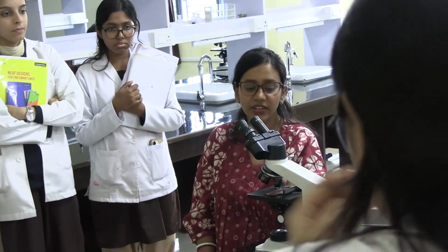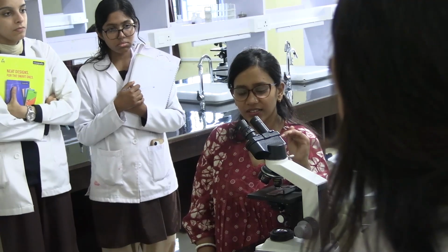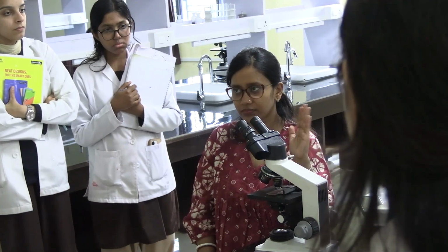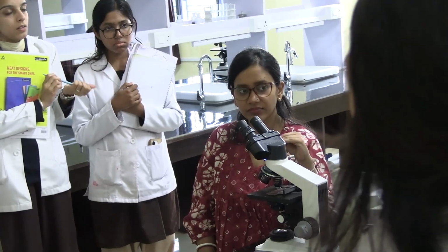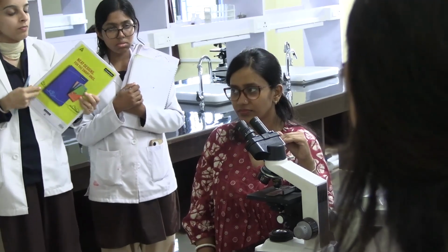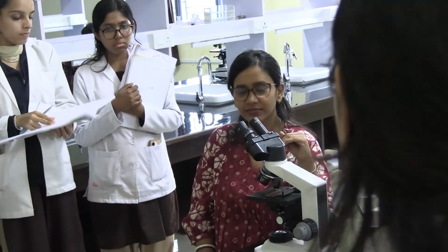Okay. So now we have the slide of adenocarcinoma of stomach. Now, what are the histological layers? Then?